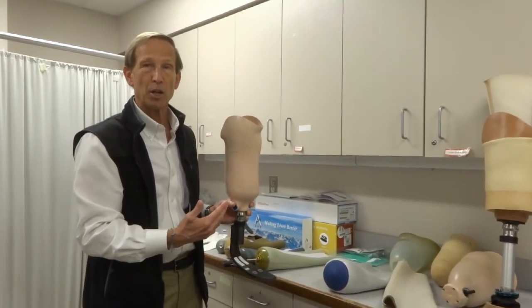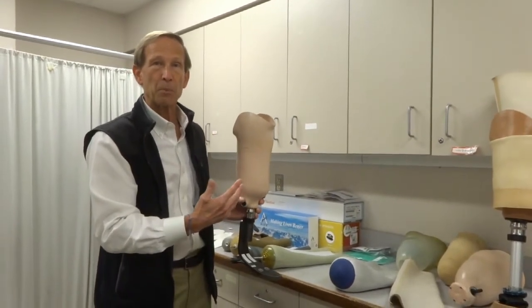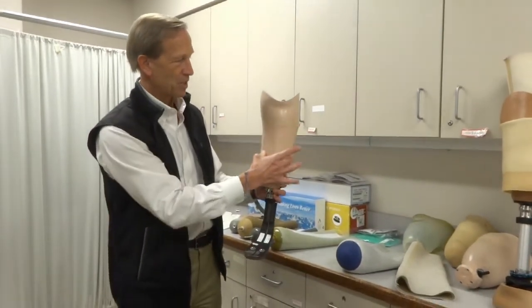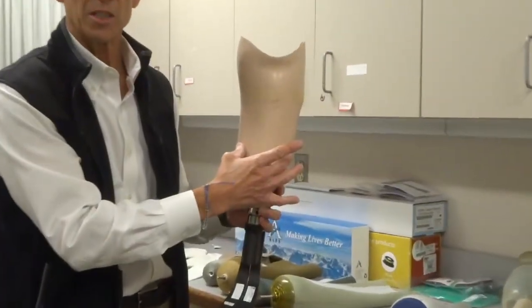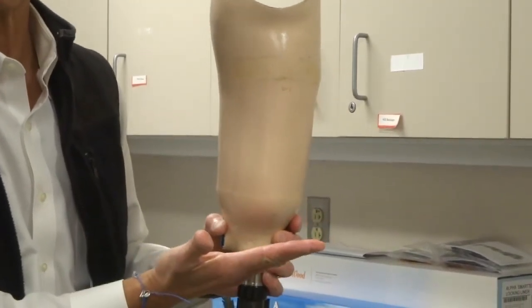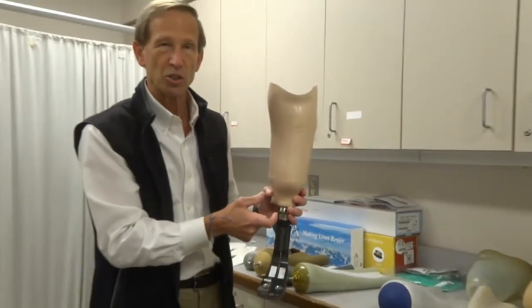That area under the kneecap is what we call the patellar tendon — the same place that you put pressure when you kneel down. So we put a little bit of extra pressure there because your body tolerates pressure there. We also try to grab the sides of the bone in the leg called the tibia, because that will tolerate pressure. We want very little pressure on the bottom of the cut end of the bone, so you want to have a little bit of extra space or cushion in there.